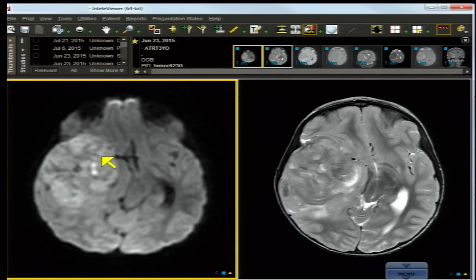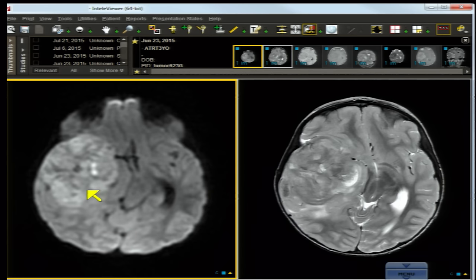This three-year-old has increasing head size, lethargy, and vomiting. The axial diffusion-restricted image demonstrates high intensity in a mass, consistent with some diffusion restriction. We'll look at the ADC map in a moment.